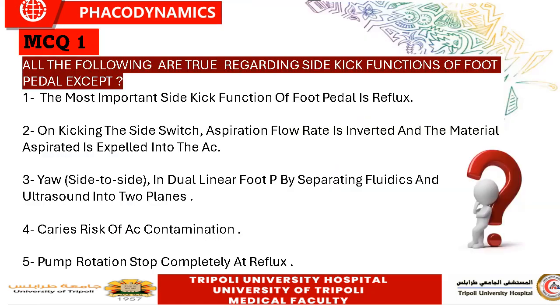To maximize our understanding of the function of the foot switch, I made this MCQ. All the following are true regarding the side kick function of the foot pedal except. So I explained before the function of the foot switch, and there is another function of the foot switch which is known as the side kick.